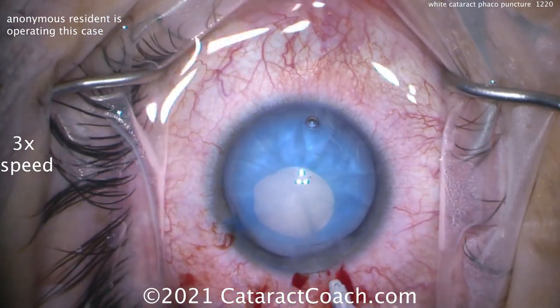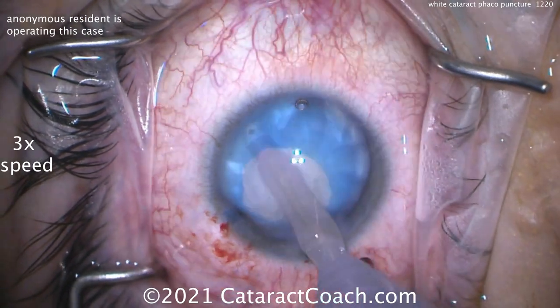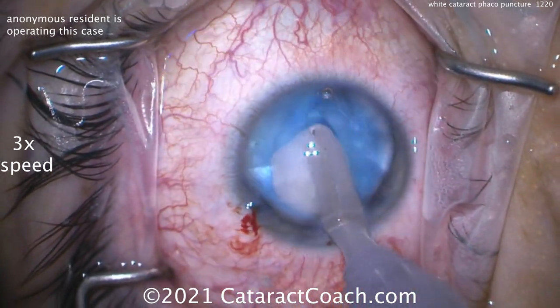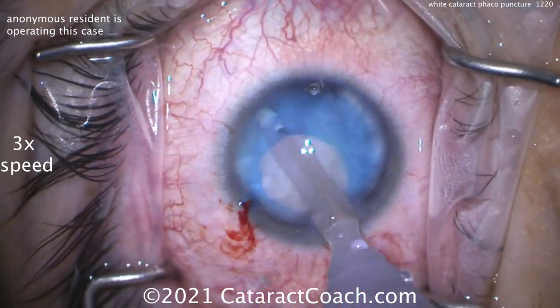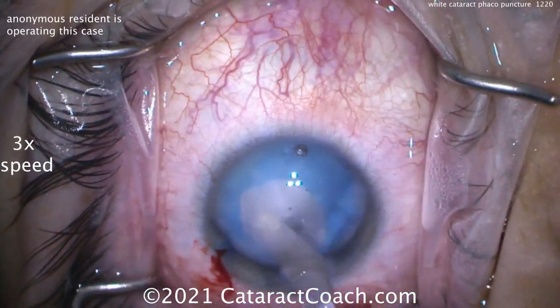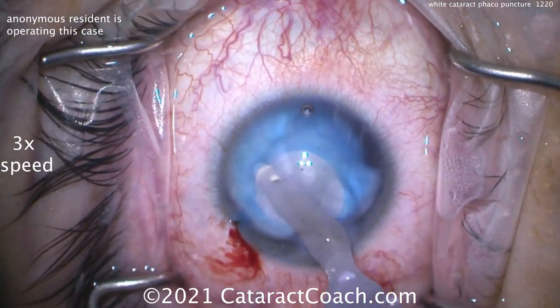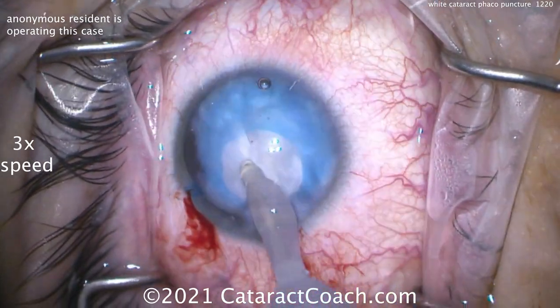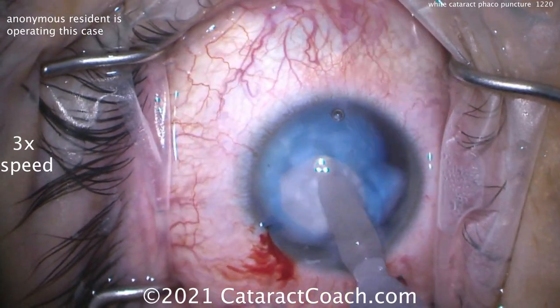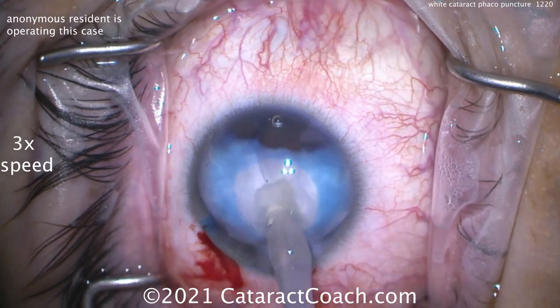Now we can put the I/A probe in the eye. It's pretty soft — remember, it's not a dense cataract — and just aspirate out all this material, really just take it out. Again, this is a younger patient; look at the eyelashes, there are no gray eyelashes. This is an intumescent cataract, very soft, it's just fluid-filled. The cortex has largely liquefied and opacified, so that all comes up pretty easily. No FACO probe at all, just the I/A probe.